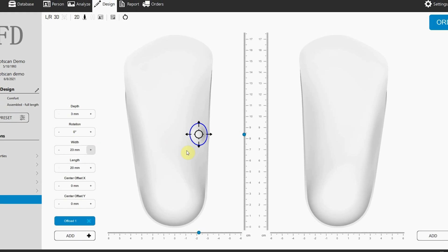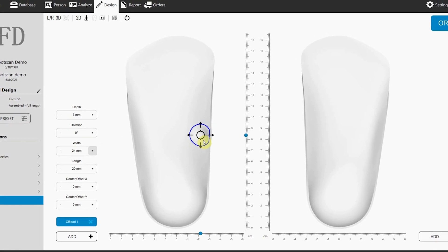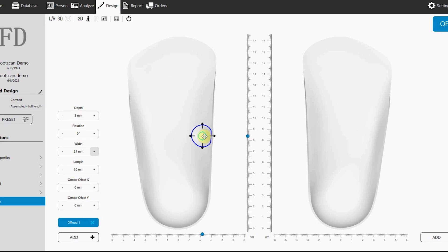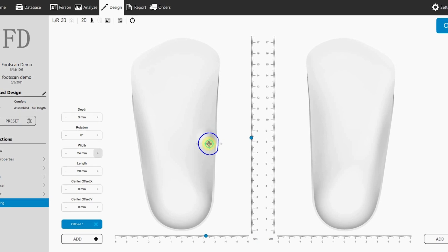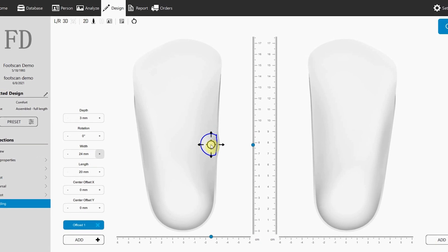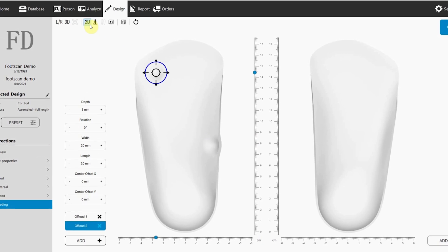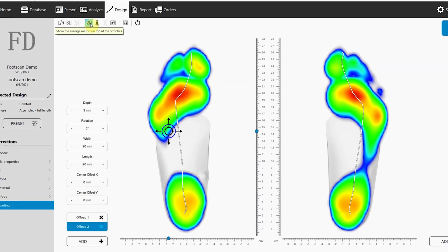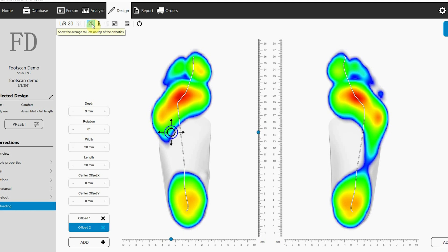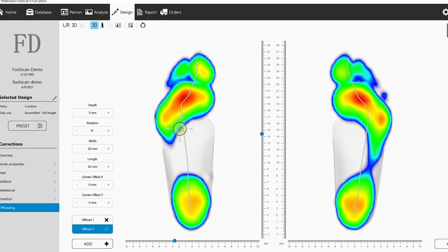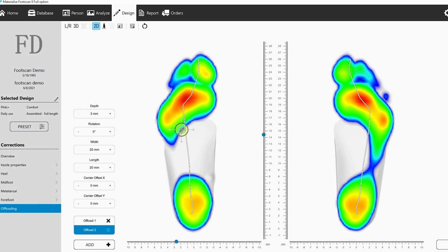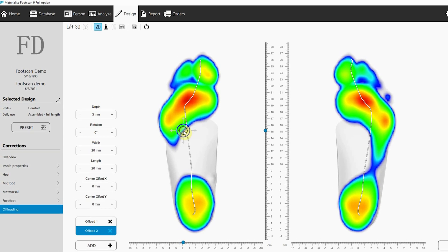Select the location, change the width and length of the area, or change the orientation and the location of the deepest point. It's all tailored to your patient.